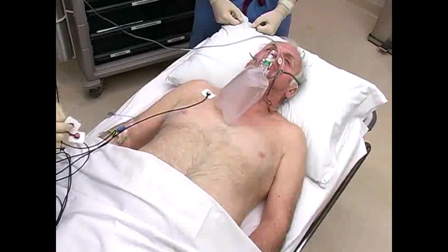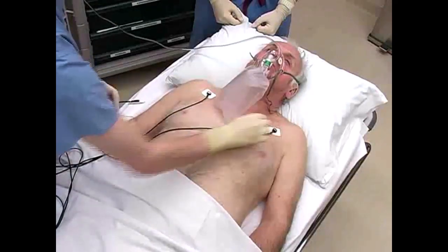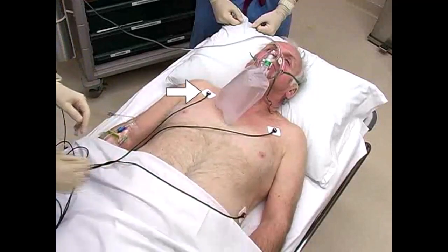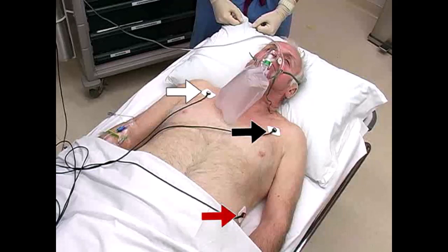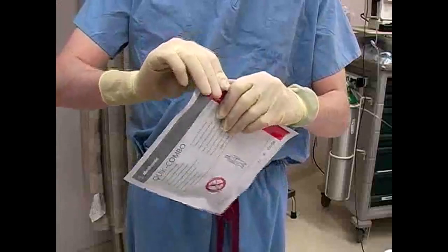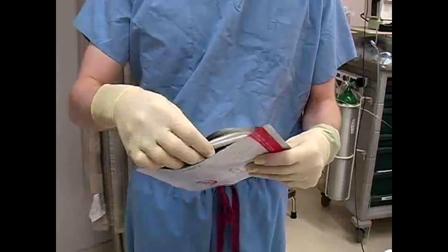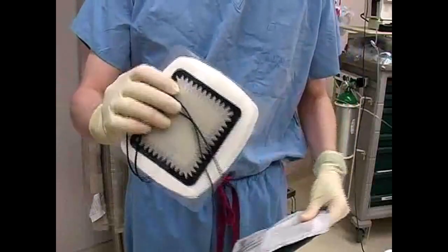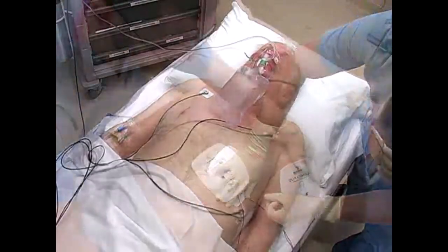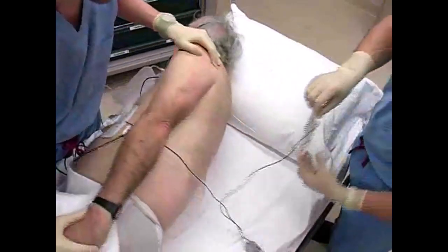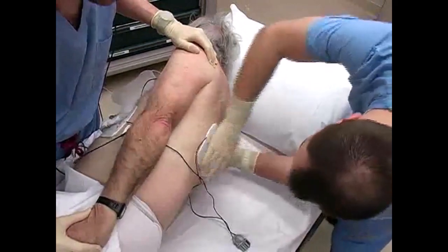First, place the monitor leads on the patient. The white electrode is placed on the right chest just below the clavicle. The black electrode is placed on the left chest, and the red electrode is placed on the left chest at the anterior axillary line just below the left breast. Next, apply the defibrillation pads in the anterior-posterior position if possible. Place the anterior pad to the left of the sternum below the left breast and the posterior pad on the back just below the inferior pole of the left scapula.